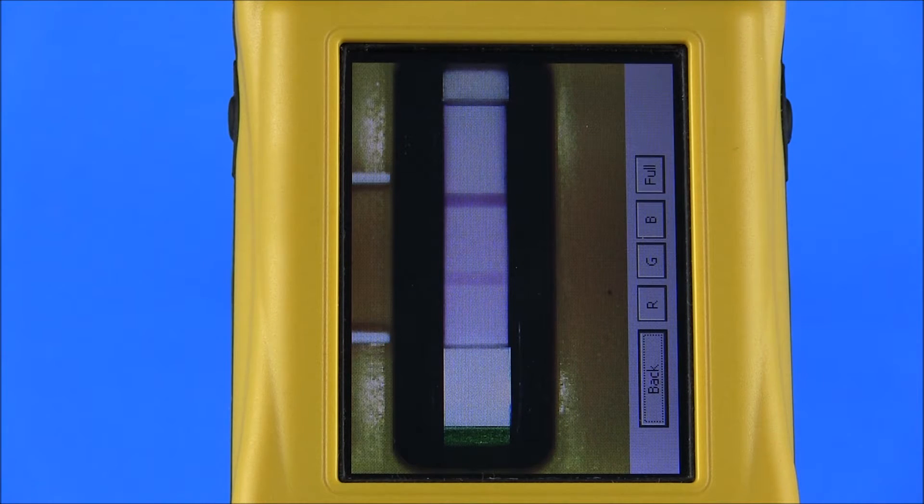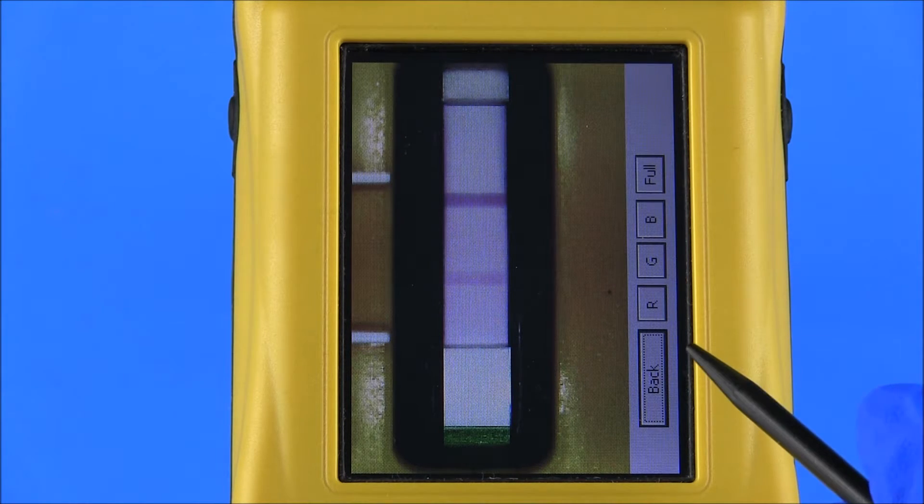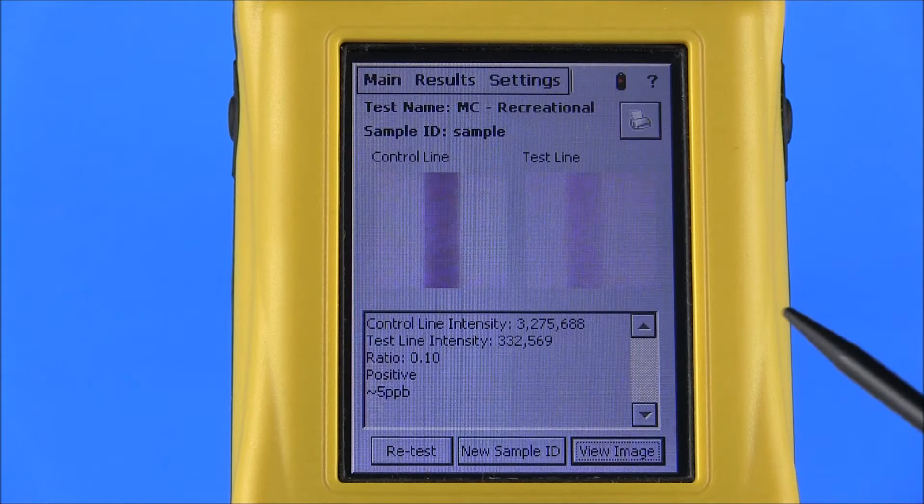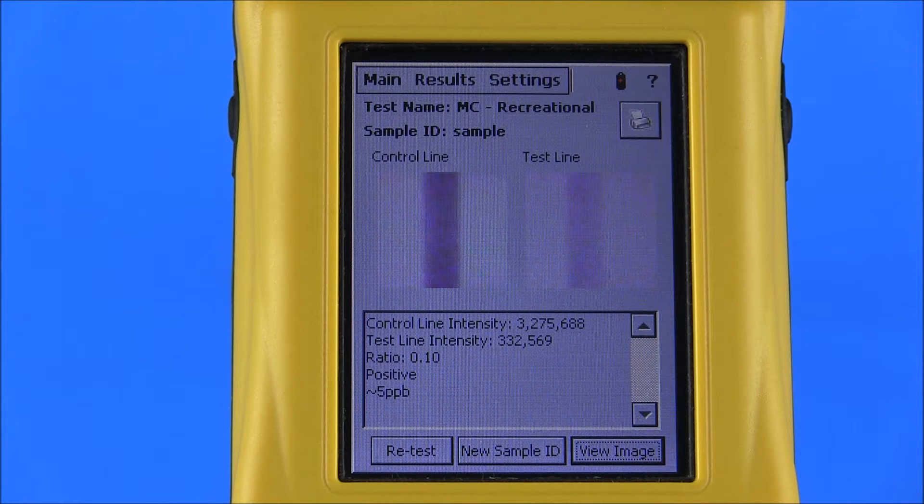The user may select Retest to reread the test strip. If desired, New Sample ID can be selected to assign a new sample ID before retesting. Select View Image to display an image of the test strip. Select Back to return to the test strip results screen. To read additional strips, remove the cartridge from the reader, remove the previous test strip, and replace with a new test strip to be read. A sample ID for the new strip can be entered by selecting New Sample ID, entering the appropriate sample ID, and pressing OK. If using only time and date information for sample identification rather than sample ID, test strips can be read in immediate succession with no additional commands necessary.